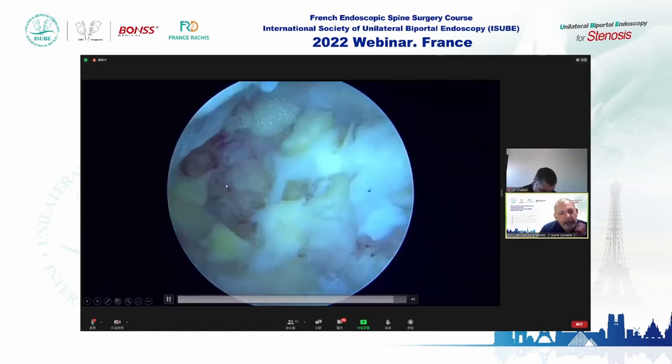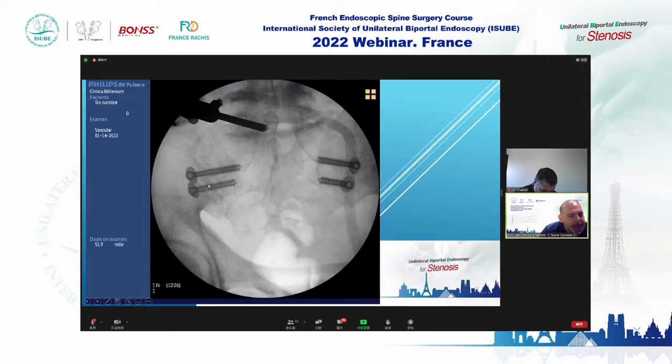We use radiofrequency to control bleeding. Then we performed a fusion of the sacroiliac joints with percutaneous screws. We have many cases of this surgery combined with decompression. The patient had relief of all symptoms, including knee pain — all symptoms of low back pain were gone.